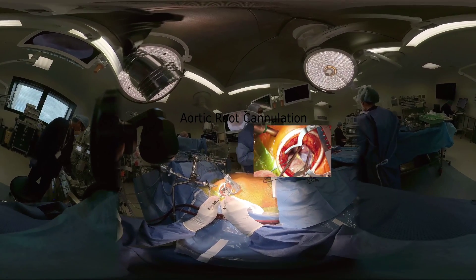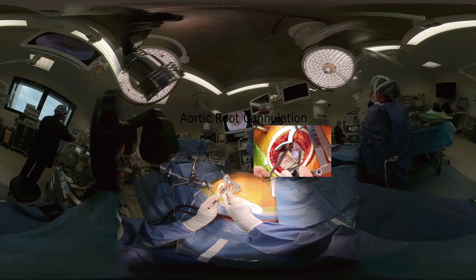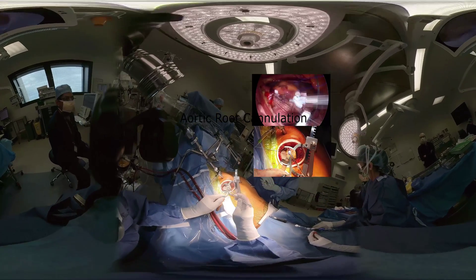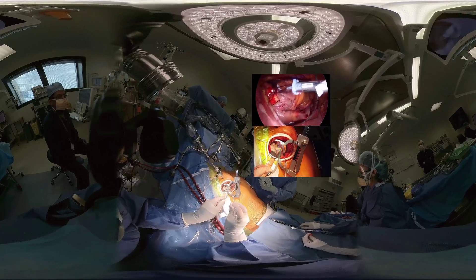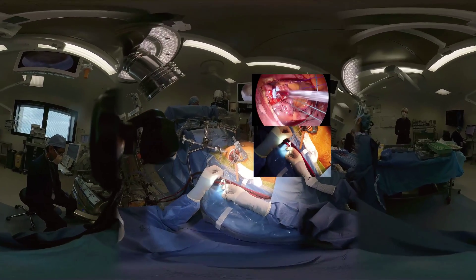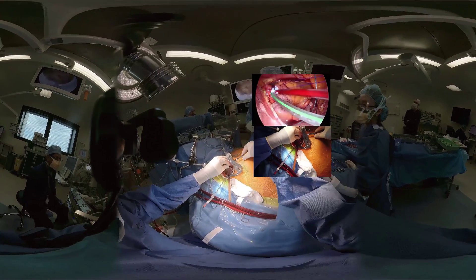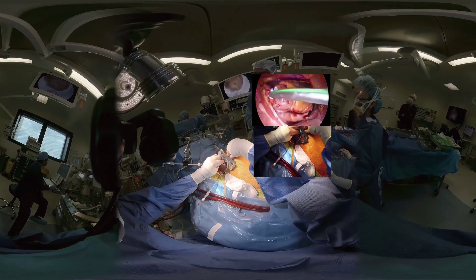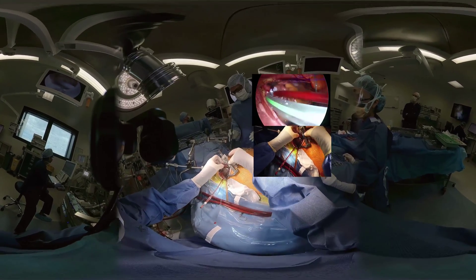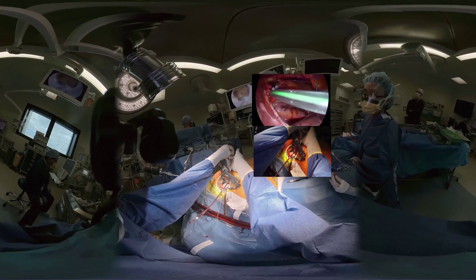Cannulating the ascending aorta for cardioplegia and for the vent is a high risk component of this operation. Although it is similar to an open procedure, endoscopic instruments are used with care taken to be as neat as possible in the first go. After many years of experience, Dr. Edwards prefers to put two pledgeted purse string sutures, with the second purse string as a safety measure so that when the root cannula is removed there is a second purse string available to deal with any small leaks without having to suture the aorta towards the end of the procedure. Using one of these sutures, a root cannula is inserted with one arm connected to the cardioplegia line and the other arm to the vent line.